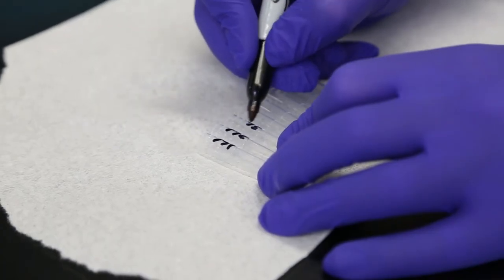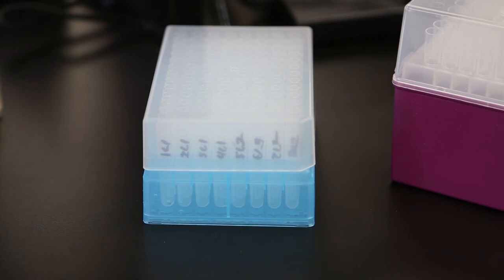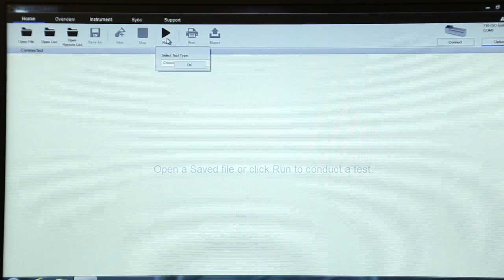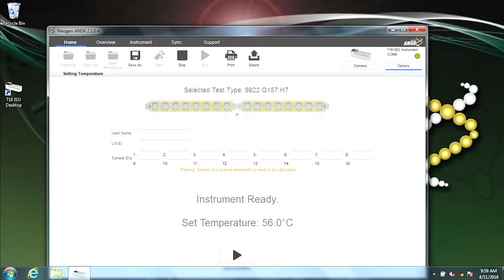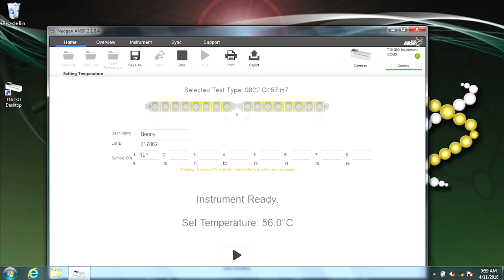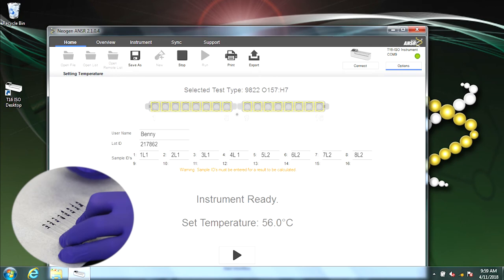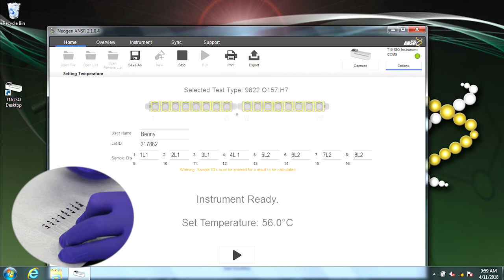Take a strip of the 1.2-milliliter cluster tubes and mark them to correspond to your labeled samples. Return the cluster tubes to the rack and label any additional tubes as needed. Remove your gloves, and from the computer, select Run. Select 9822 E. coli 0157H7 from the Test Type drop-down menu, then click OK. Fill in the username and lot ID from the kit and corresponding labels from your samples in the sample IDs. These should match the cluster tubes as well. If you do not put in a sample ID next to the well number, the reader won't read it even if it has a sample. Be sure to provide an ID for every well you're running. In this case, we are only running 8 samples, so wells 9 through 16 are empty. Any number of tests can be run at once. It does not have to be in multiples of 8.